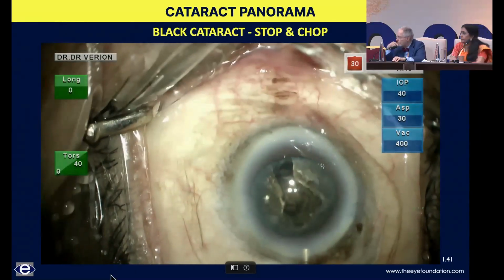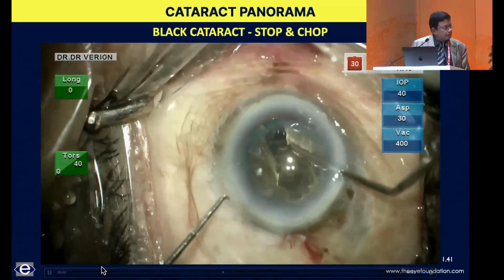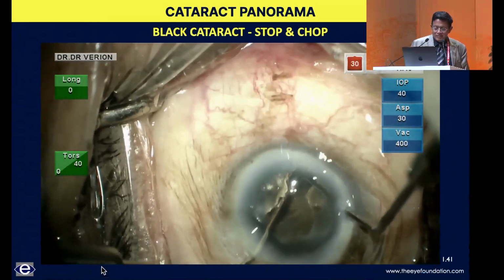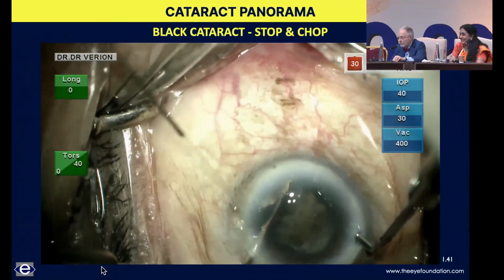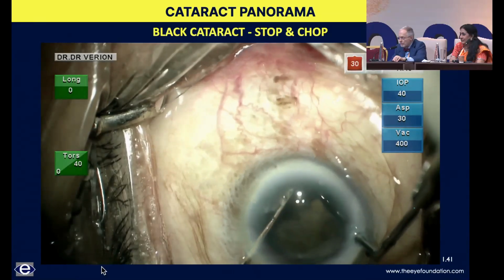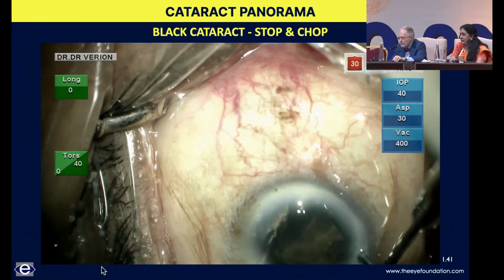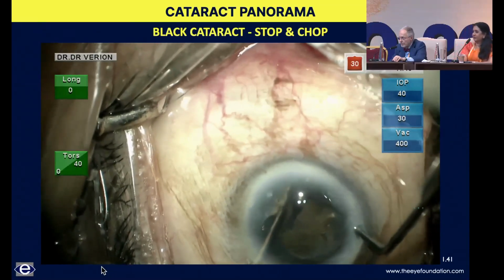I'm going to do exactly what you said. Oh, okay. You taught me this. I did? Yeah, see, that's so controlled and so gentle, and you can just see where it peels apart. That's a textbook example of how that works.